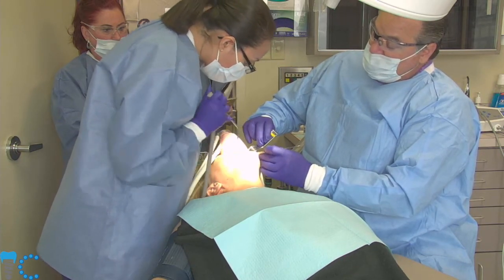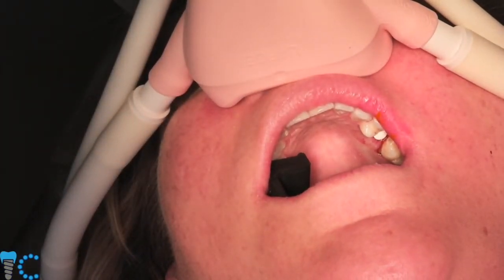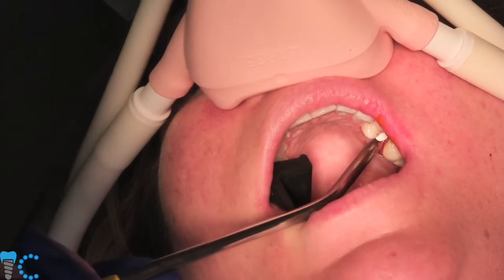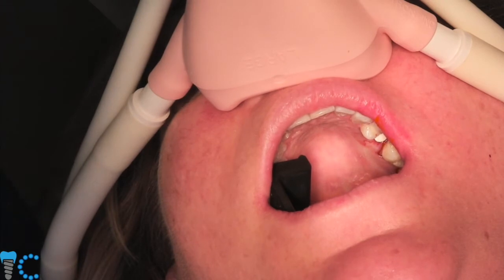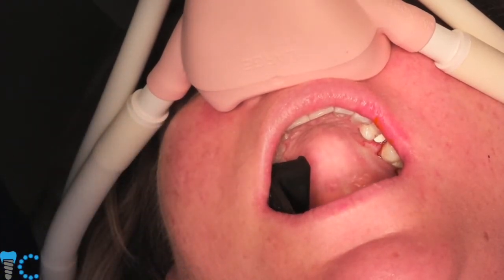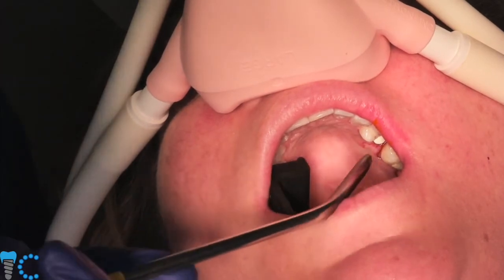Very, very similar, to be honest with you. Again, all the studies in animals, mini pigs, dogs, etc., would confirm that, especially at later time points, like the time point where you want to restore the implant. But let's just say they're so similar, our treatment protocol's the same thing. So if we place an implant like this, even though we're in the maxilla, we're going to wait 3 months. 3 months, we'll have this patient back and we're ready to restore this implant.